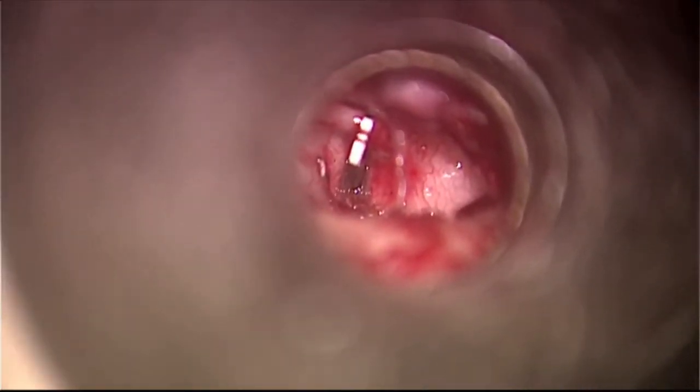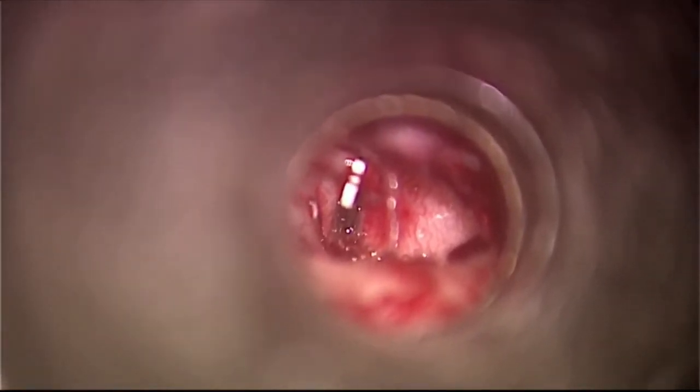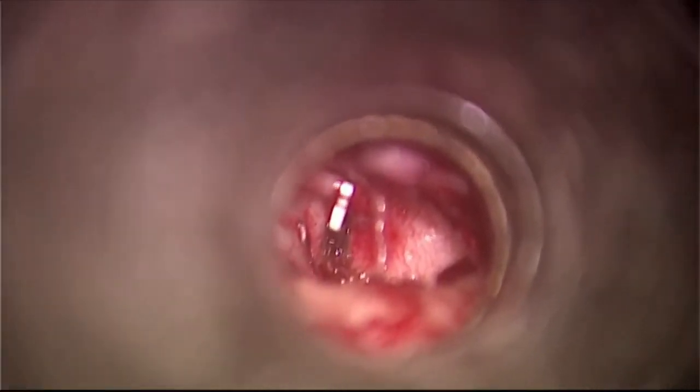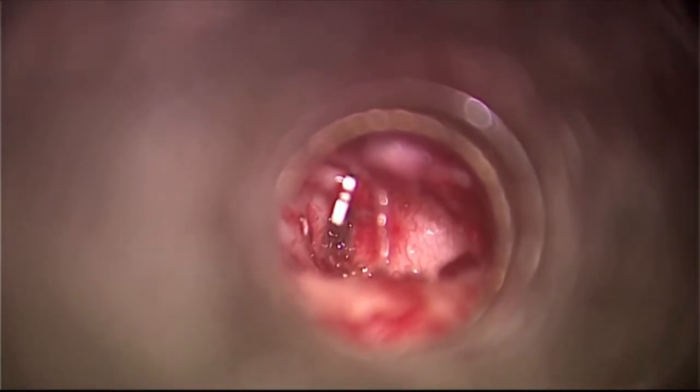It looks so simple, but believe me, it's not simple. See, it doesn't take more than 5 minutes once the canal is opened. The problem with Satish is he makes everything look simple. Yes, that's why we are here, so that anybody can do it.